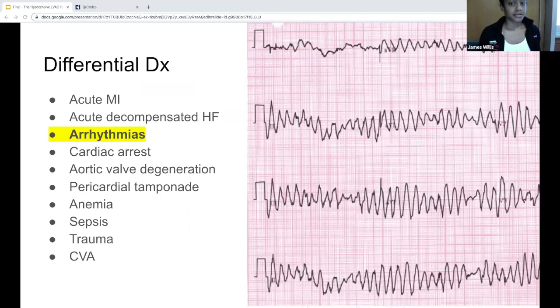Arrhythmias are very common, especially in the first 30 days after getting the LVAD put in. And they're already at increased risk because they have ischemic heart disease or other types of cardiomyopathy. So run through the ACLS protocol if you need to, placing the pads away from the LVAD or the ICD if they're present. Defibrillate unstable patients; stable ones, even those in VTach or VFib, can be medically managed. A lot of these patients will also have ICDs at the same time. So if they're complaining of palpitations, shortness of breath, or shocks, you definitely want to have the ICD interrogated.